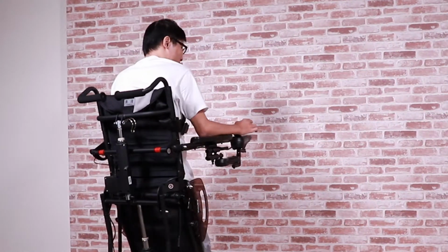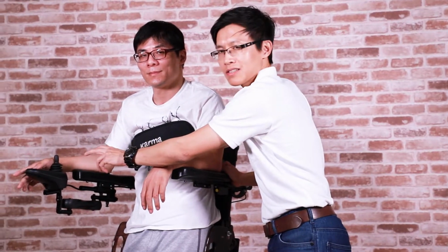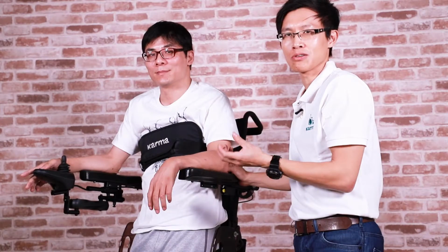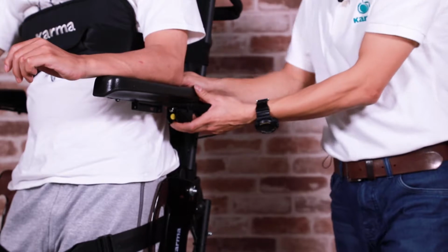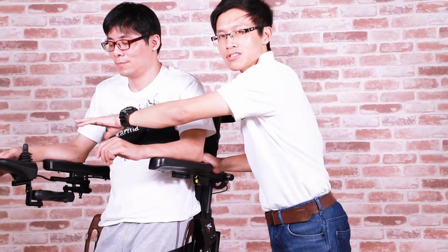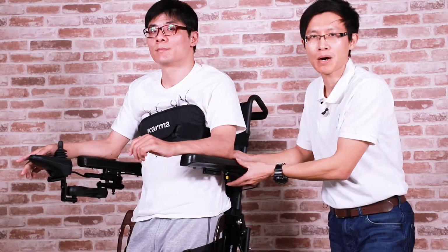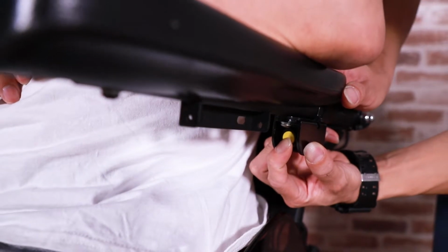Karma Ergo Stand has several safety designs. First of all, the controller will reduce the driving speed by half while the chair is in a standing position, for safety reasons. Secondly, there is a yellow button located underneath the armrest. This button is designed to provide an alternative command to the chair to sit down in case of emergency. For example, if the main controller shuts down, simply press and hold this button. The chair will come down slowly.